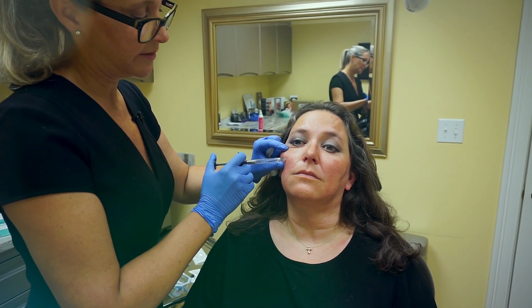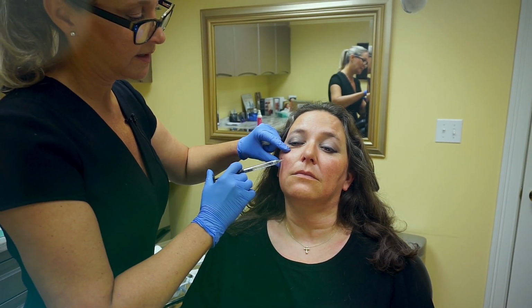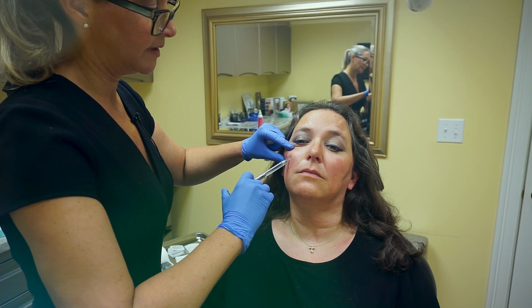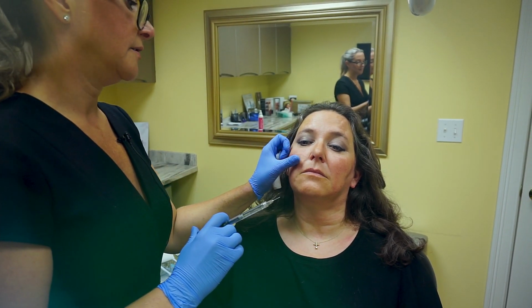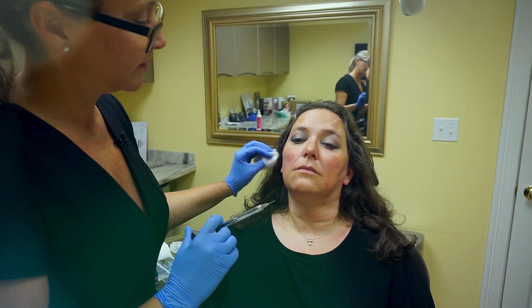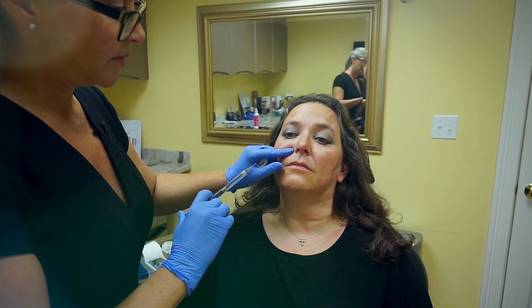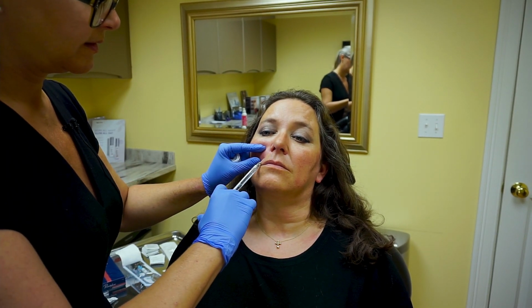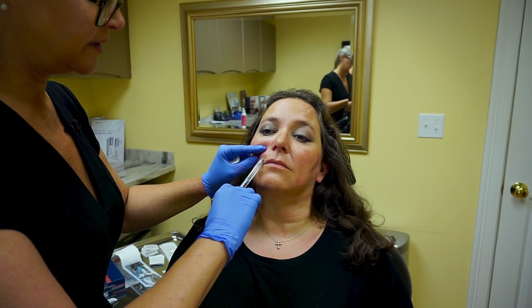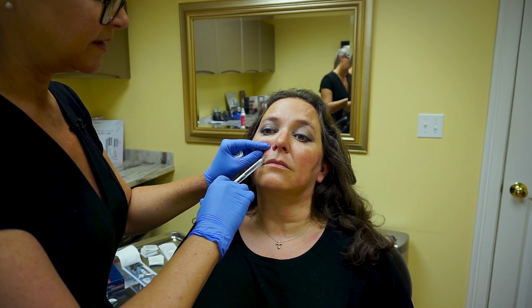And I'm using a needle to inject this. If I were going into the tear trough, which is this area under here, I would be using a cannula for it, but because I'm not there, it's not really necessary. Jody doesn't have deep tear troughs, so we don't have to fix that. And I'm going to keep going into the nasolabial fold so we get a complete correction of the nasolabial fold. I filled a little bit in the deep layer with some Lift, so that's good.